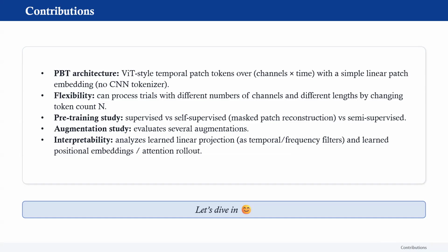It is not done very often because when you feed the raw signal, there's a lot more you can do. You can play around with local features, global context, you can combine them, you can split them into different frequency bands depending on what you think might be useful. So the more common approach would definitely be to just work with the raw data.